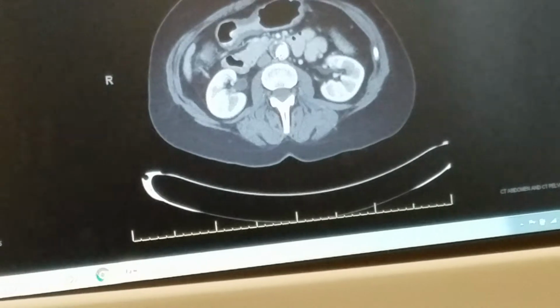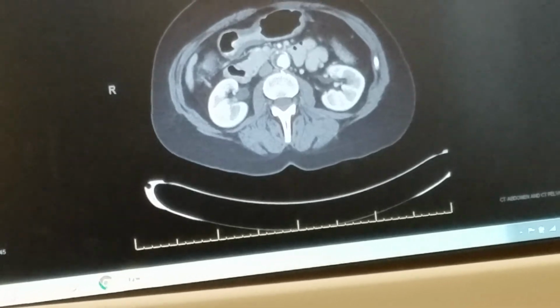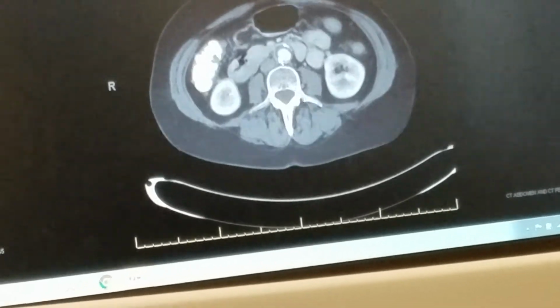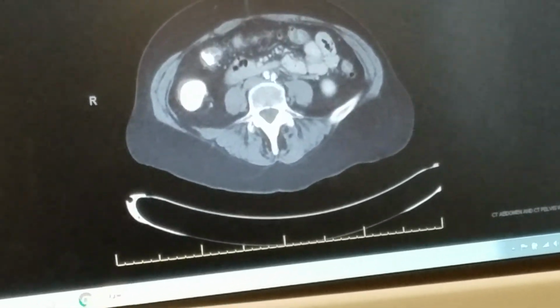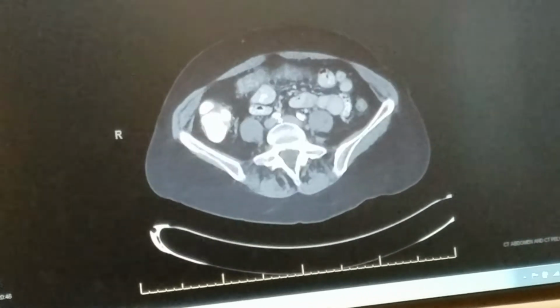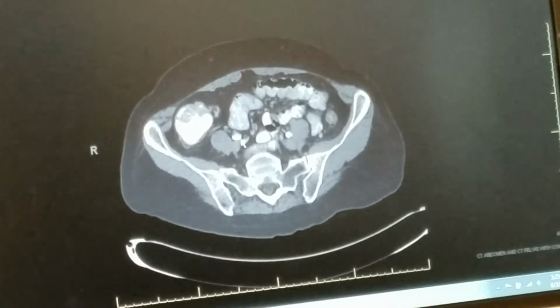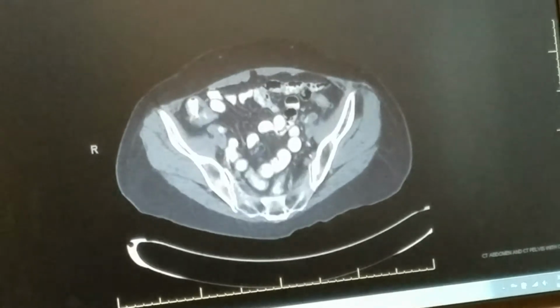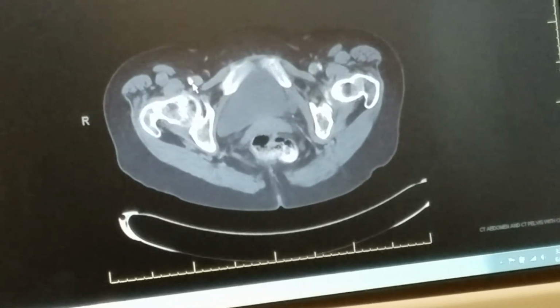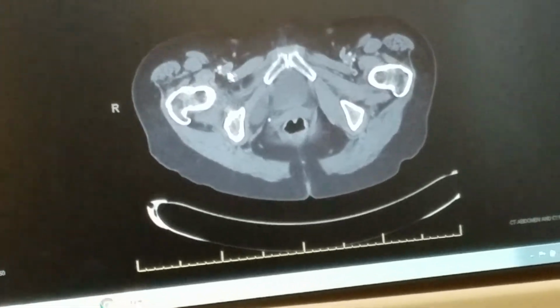You notice that there's a bulge here. Oh, I see it. And there's a ring of clot right here. And it gets bigger. See that? Right there. Wow. And then it gets small again, and here's the arteries, and you can see the white. These are the plaques that are in her artery. All this white stuff here. See all this stuff back here. This is what we are kind of dealing with, removing. And down at the groin too, she has a big chunk of plaque here. So it's about half of her vessel is filled with just chalk, calcium.